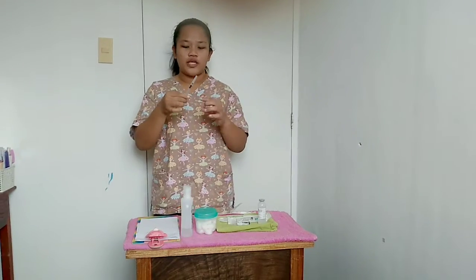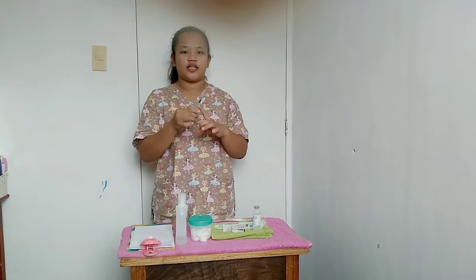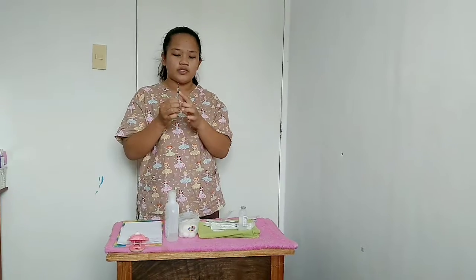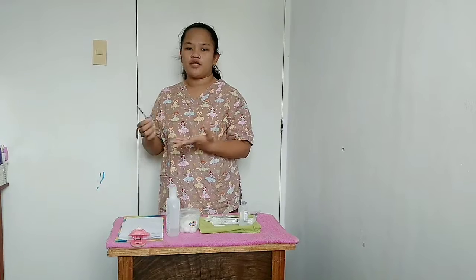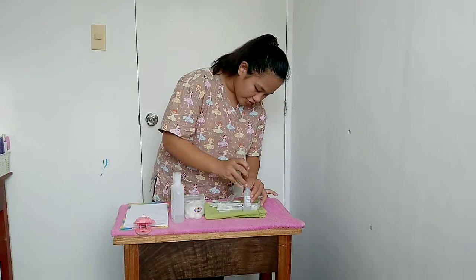Make sure that the connection of the aspirating needle and the syringe is not loose. The amount of air that we withdraw is equal to the amount of medication that the physician ordered for the patient. Then we are going to inject the air into the vial.